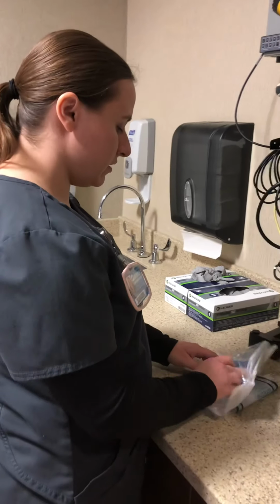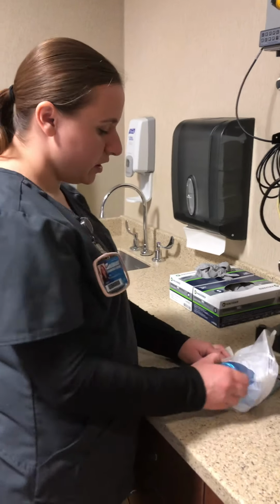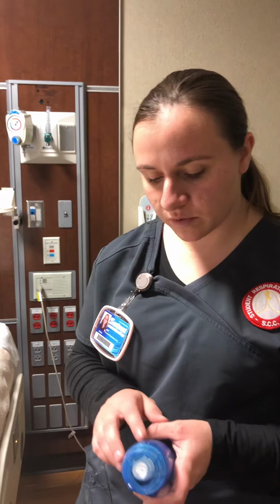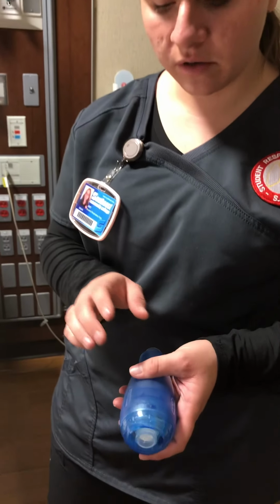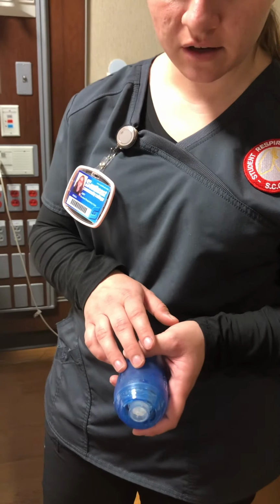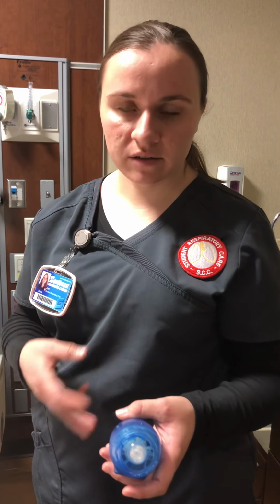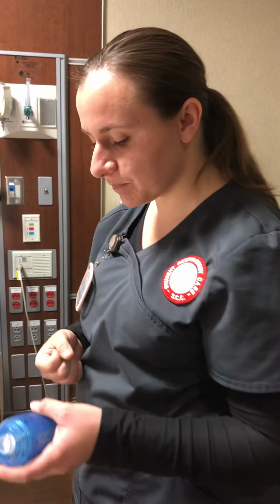So with the acapella, here's the acapella, it has a flutter valve inside, so you want to set it at the least resistance, especially for an elderly patient. That way, when they do it, sometimes an elderly patient can't get a strong enough expiratory rate to blow through and get that fluttering in their lungs to get that secretion out.